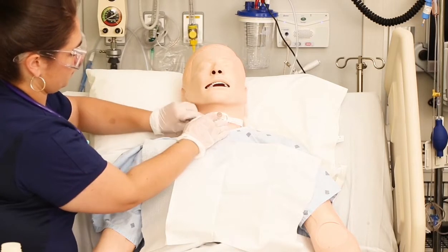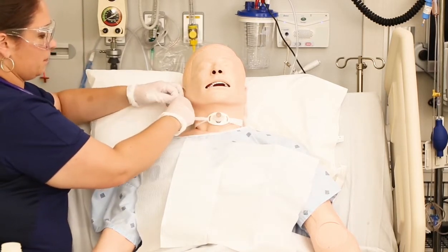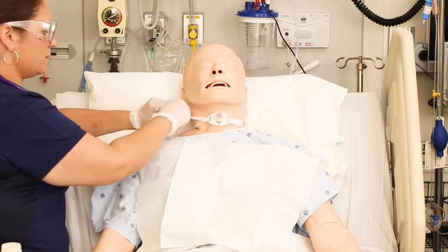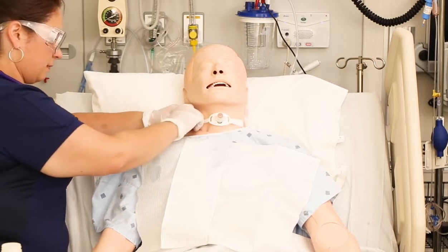So once you've pulled the ties through, you can secure them with a knot. If you don't feel comfortable doing this yourself and having one hand on the trach, get a helper, have somebody come in and just put their 2 fingers on the trach for you and hold it while you do this.